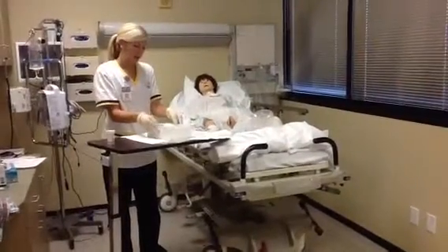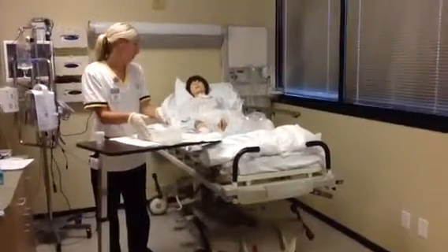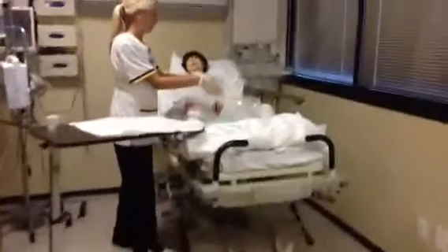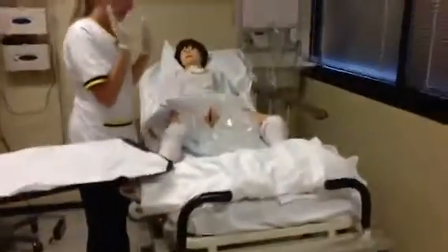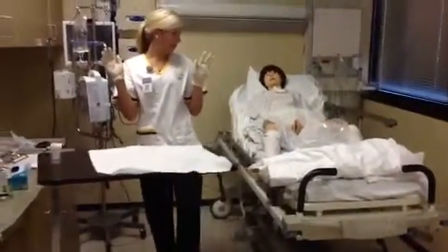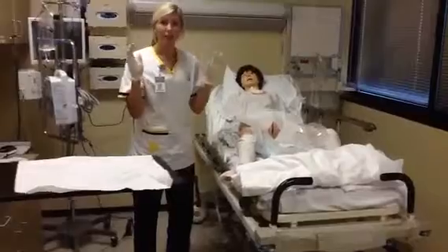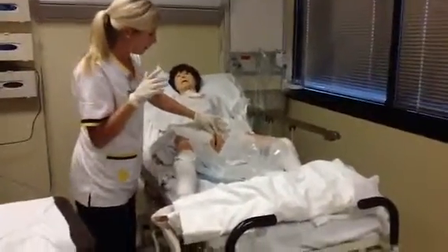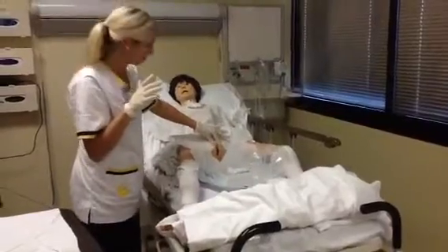And I'm going to drop this over on my other sterile field. Again, not reaching over too much. I'm going to place it down. I'm not done with this sterile field, so I'm going to move it out of the way. So to begin, I'm going to take my non-dominant hand, and I am going to contaminate it because I'm going to hold it over here to keep the labia open.